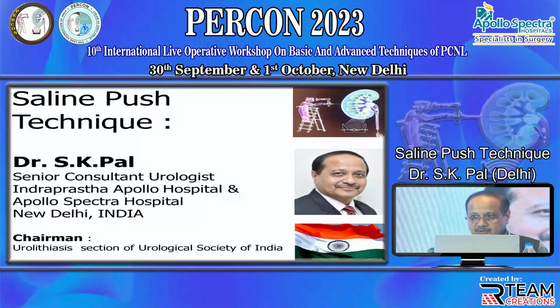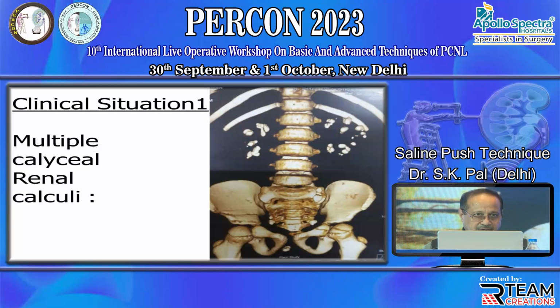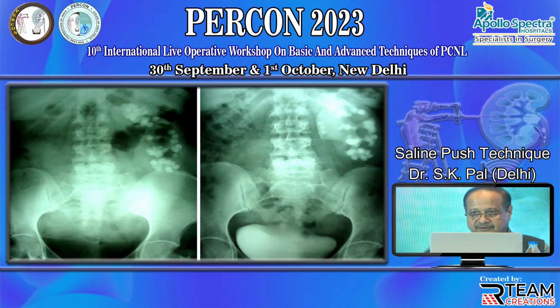I will be talking about saline push technique. Very frequently we encounter this situation. Two situations. Clinical situation 1, when there are multiple calicial renal calculi, they may be situated together or they may be lying in different calyces. Now, how to take them out?